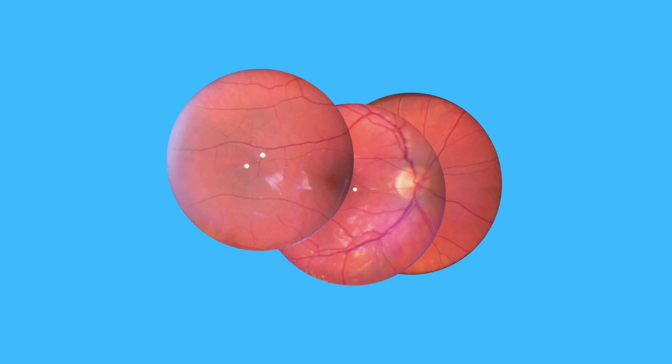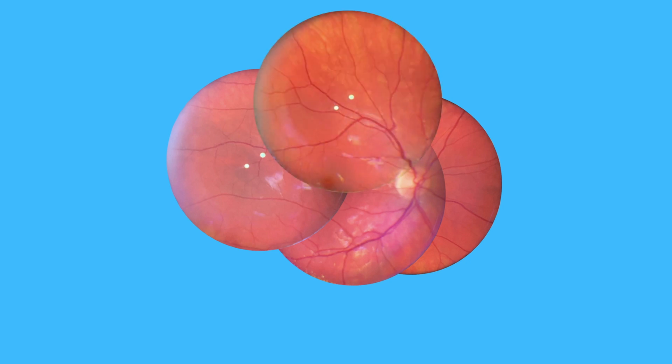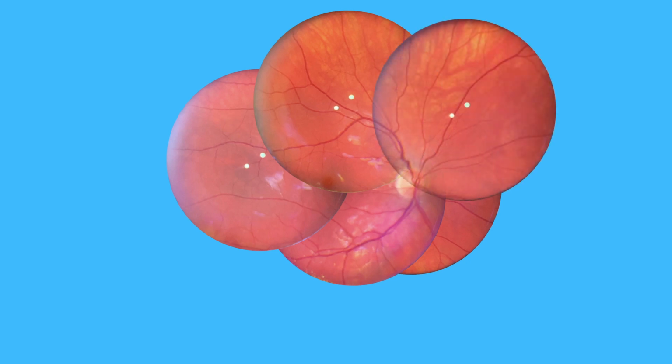Next, we will acquire images from the vascular arcades, and we will start with the superior part of the retina. Center the field of view at the temporal superior arcade at a distance from the disc where you still see the disc at the border of your field of view. Next, acquire an image of the nasal superior arcade, again with the disc at the border of your field of view.